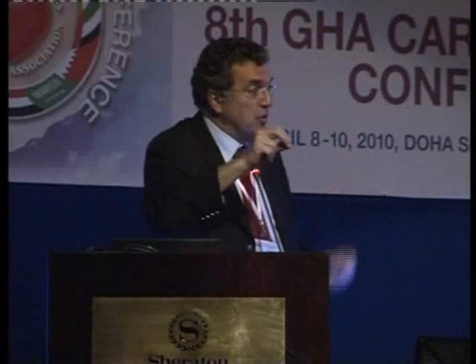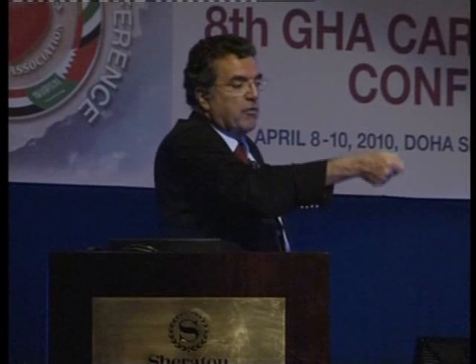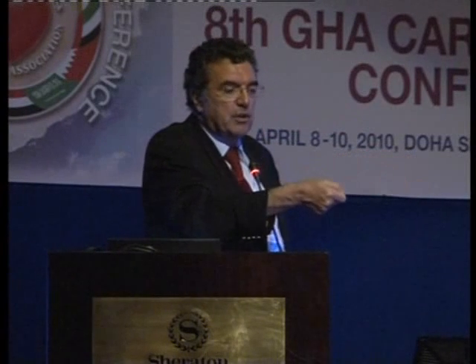But if you have diffuse disease and several lesions in the vessel, you need to do a pullback, and to do that you have to use intravenous infusion of adenosine. Then we do the pullback from the distal lesion to the intermediate lesion, from the intermediate lesion to the proximal lesion, and from the proximal lesion to the guiding catheter. Then you can measure the gradient for each step of the vessel. This is the second way to use the FFR.